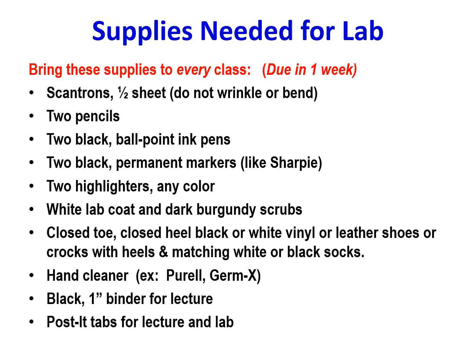You will need closed-toed shoes. You can wear Crocs as long as they don't have the holes in them that would allow blood and body fluids to go through that hole and get to your feet. They have to have a heel on them, so they can't be open like flip-flops in the back. They need to be either vinyl or leather. They cannot be cloth. They can either be white or black, but if you wear white, you need to have matching white socks, and if you wear black, you need to have matching black socks.